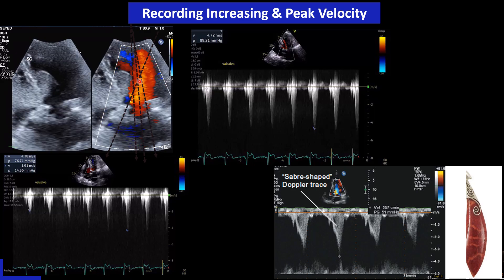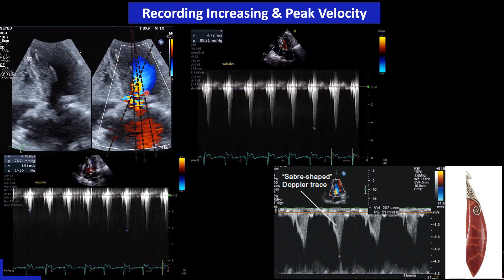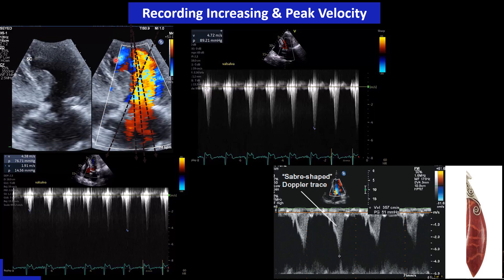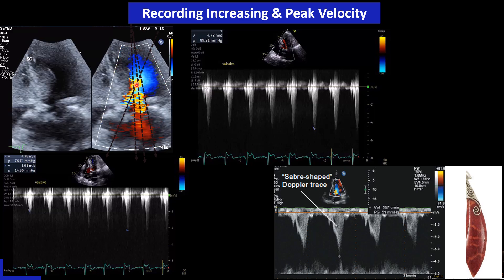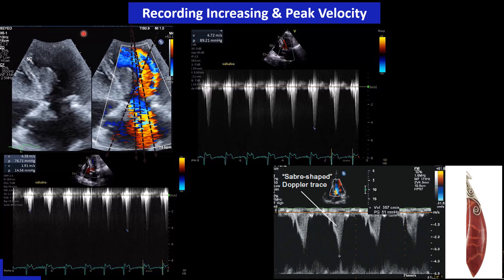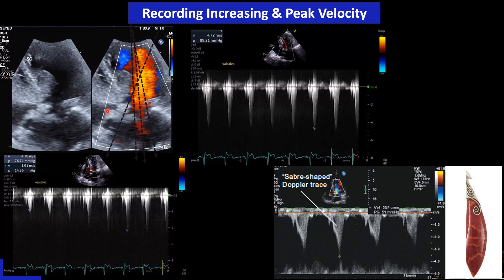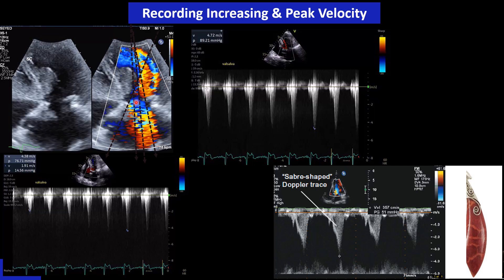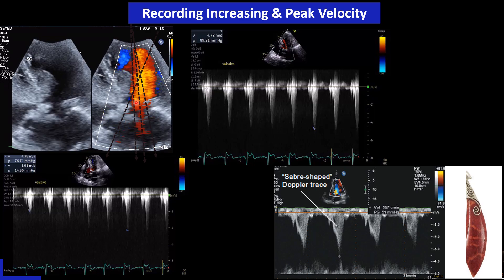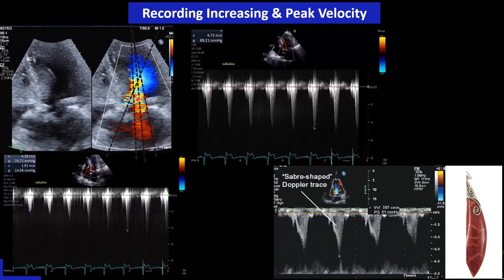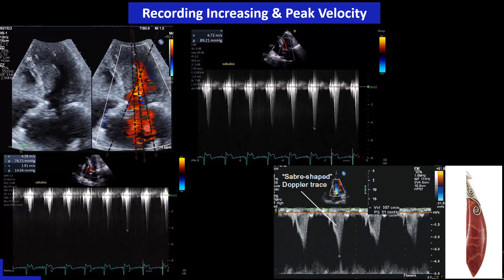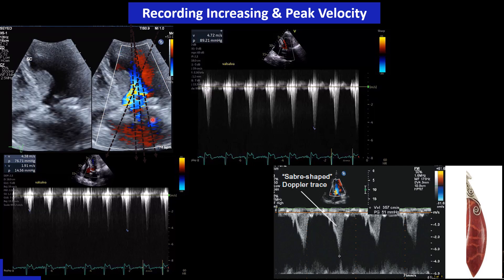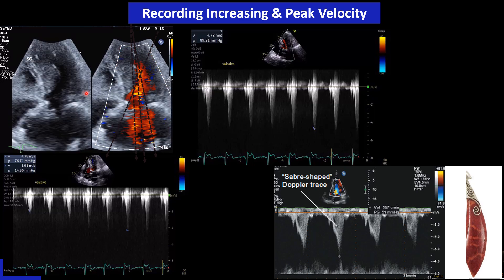Performing this is slightly different on different machines. On the Epic machine, pressing Update goes live — as you move the cursor it immediately shows the Doppler, so you can slowly move it and see changes in real time. On the GE machine, unfortunately, moving the cursor does not update the Doppler live; you must move it once, wait for the Doppler at that level, then record another clip with the cursor in a different orientation. So on GE you must repeat this many times in different directions until you find the highest velocity with Valsalva.